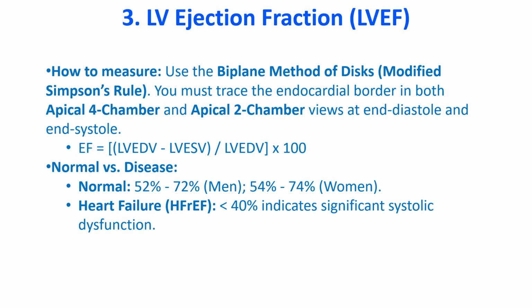Normal is 52 to 72% in men, 54 to 74% in women, and heart failure with reduced ejection fraction has left ventricular ejection fraction less than 40%, indicating significant systolic dysfunction.